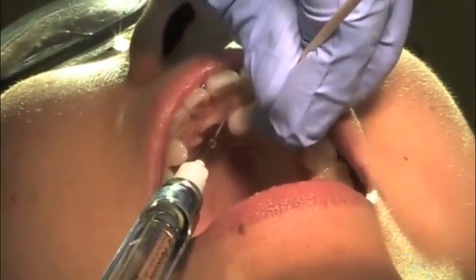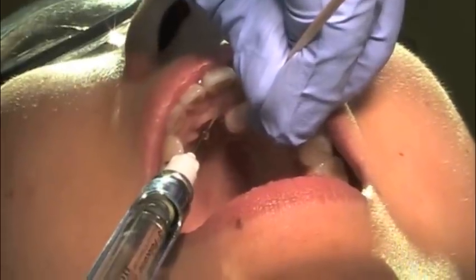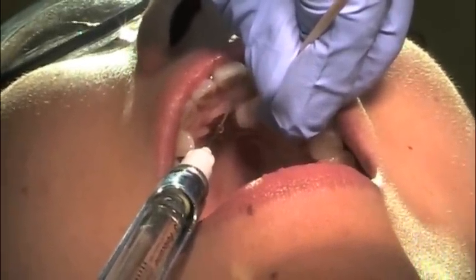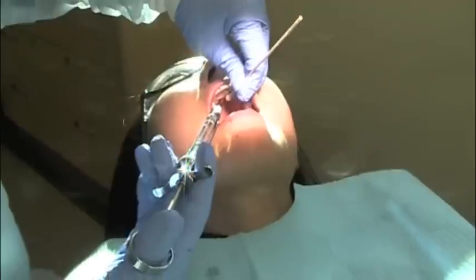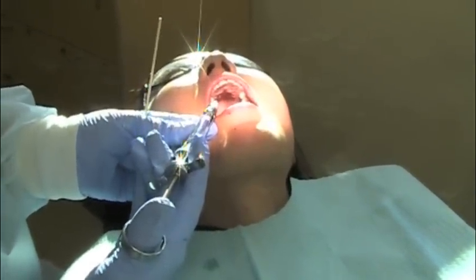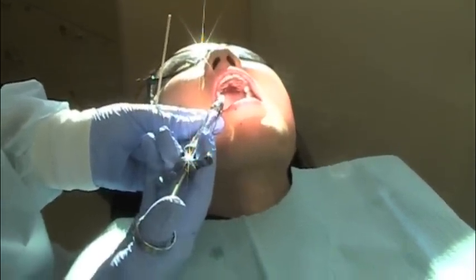Place the syringe at a 45-degree angle towards the insertion site. Roll the cotton swab and insert the needle until osseous is contacted. After a while, the non-dominant hand can be used to stabilize the syringe.